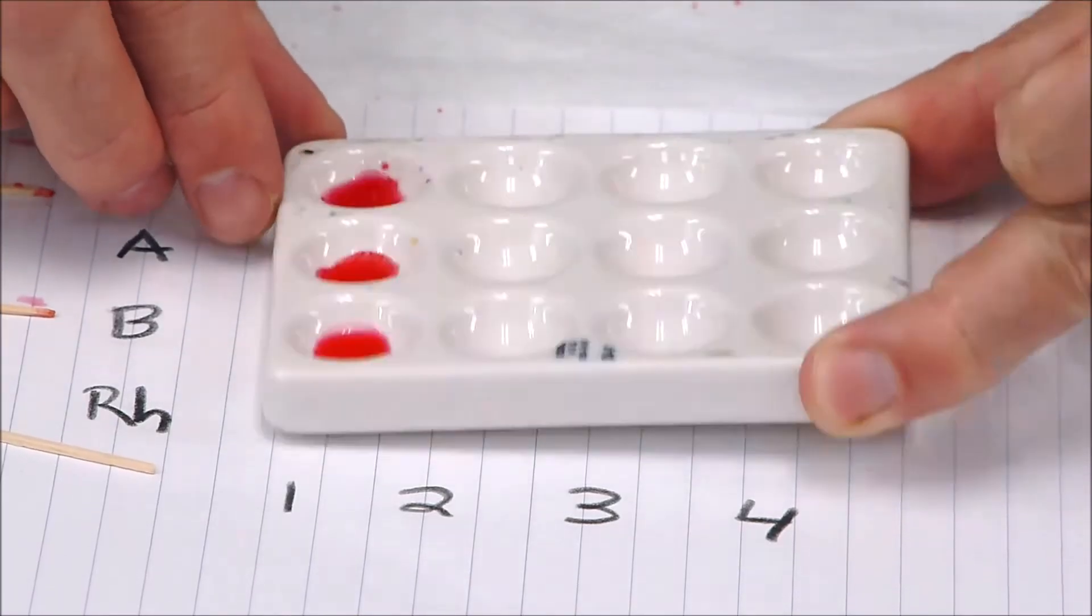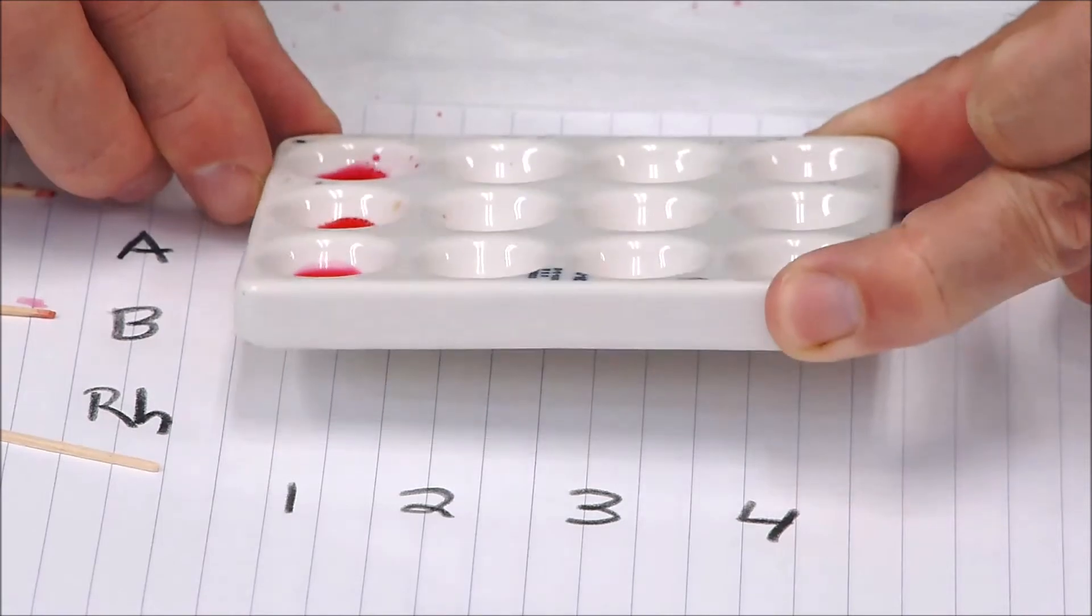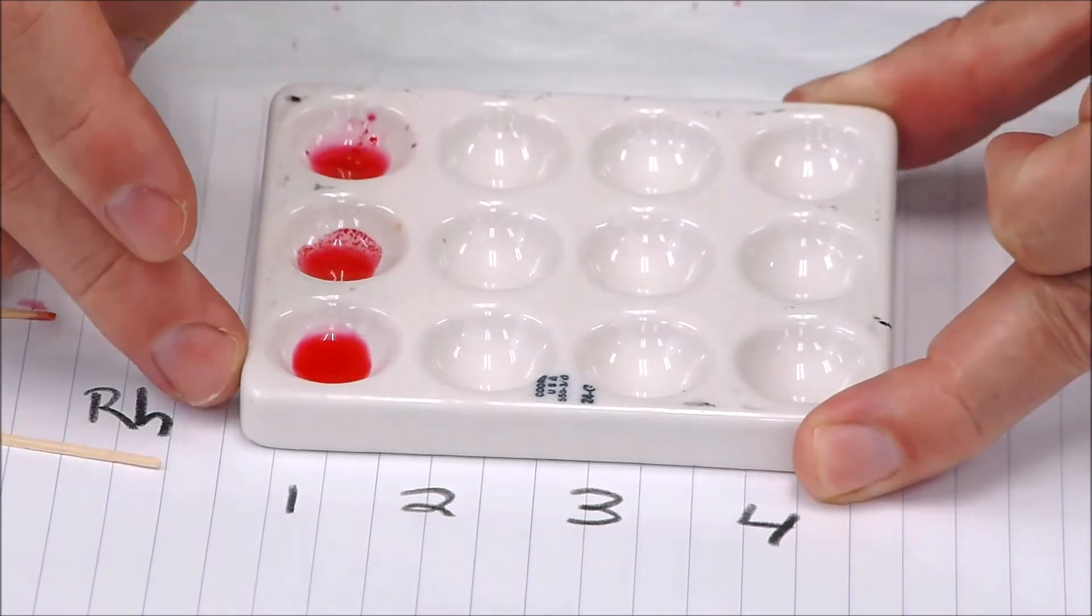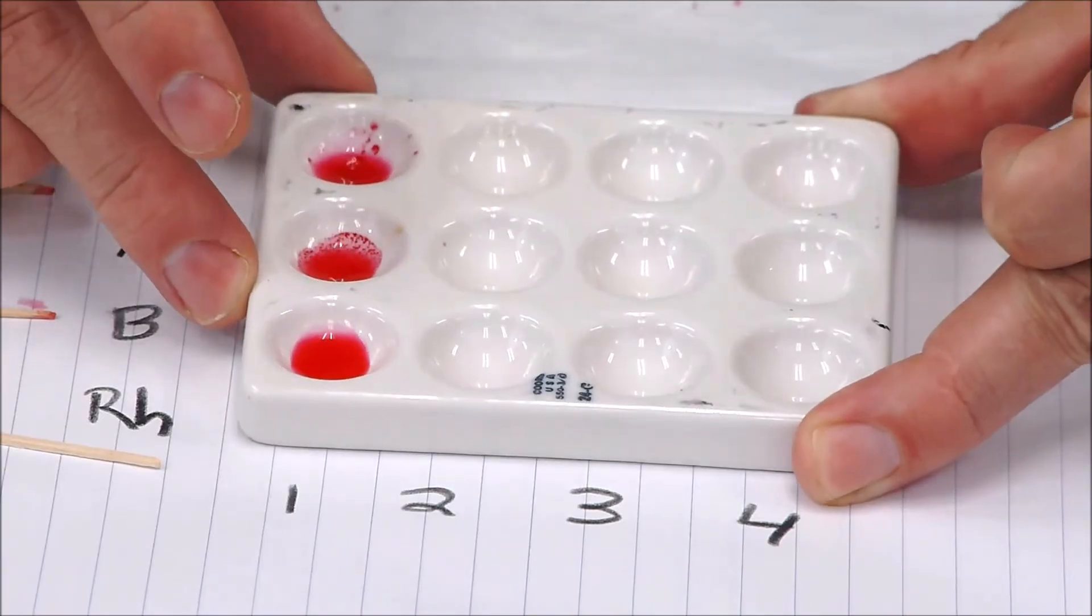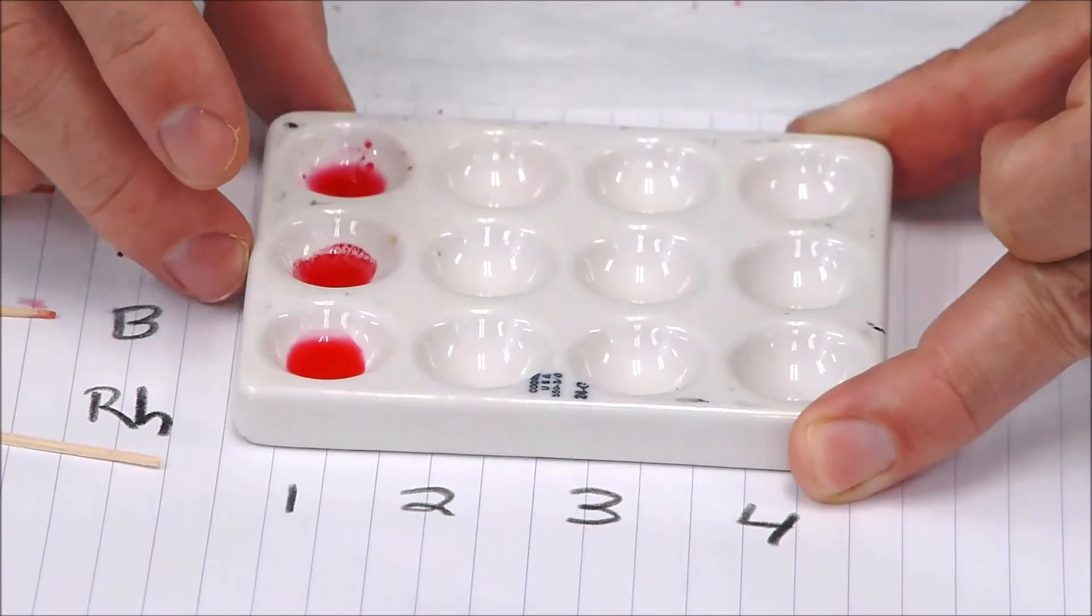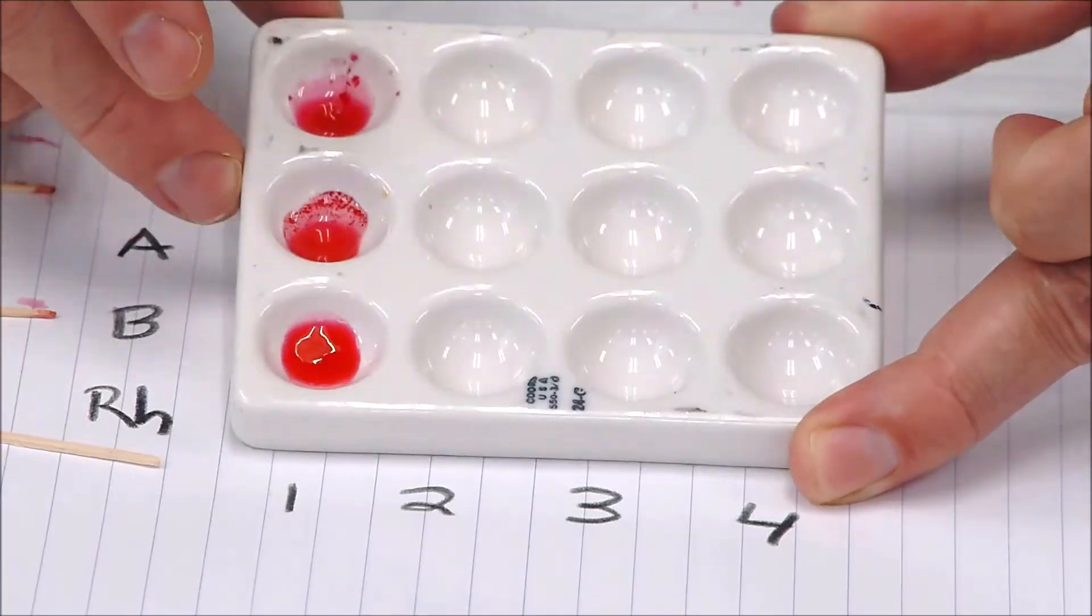For A here, I don't think I have a reaction right now—we'll come back and look at that in a second. And it doesn't seem that I have a reaction on the Rh factor. So right now it looks to me like this is going to be B negative blood, but we'll give it time to continue to react.